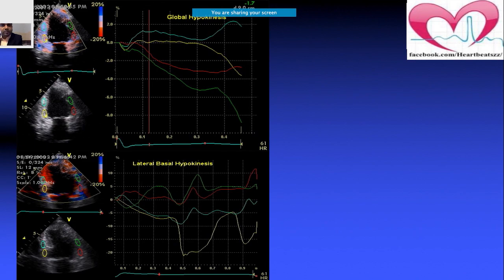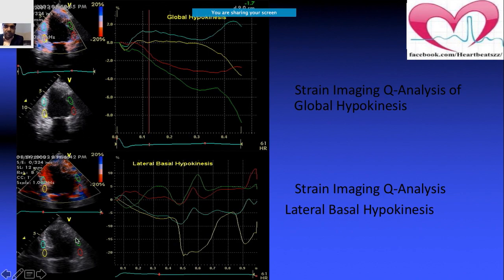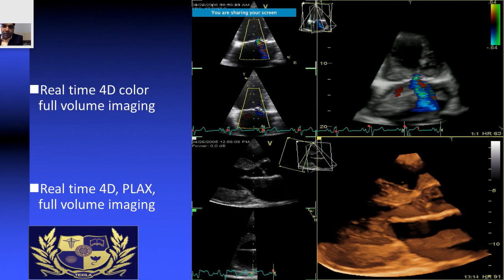This is strain imaging, used to visualize global hypokinesia. The second example shows lateral wall hypokinesia. In strain imaging, you track specific points and observe their movement during different phases of the cardiac cycle. When those points show minimal change over time, it indicates global hypokinesia. The second case shows lateral basal hypokinesia.